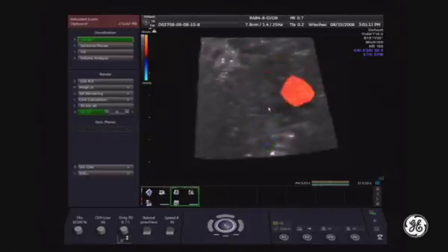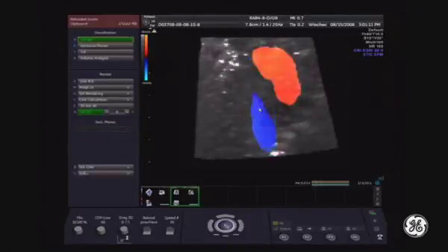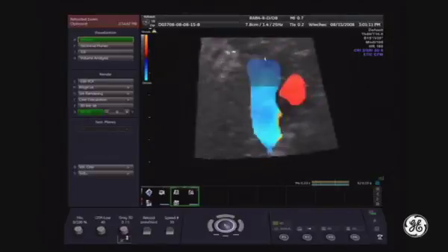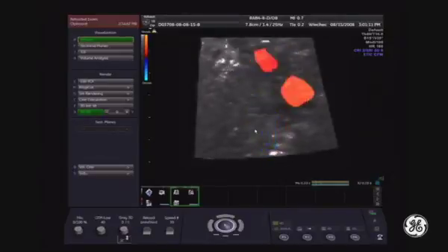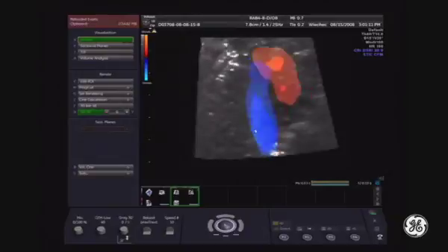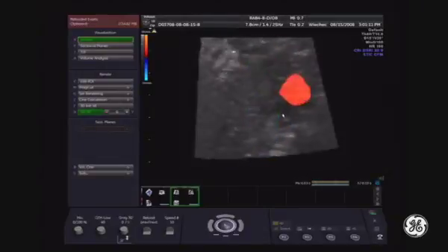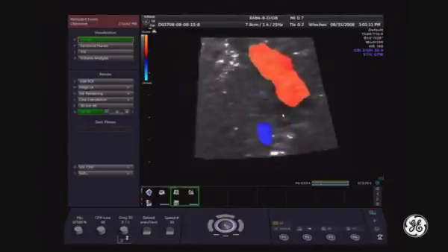Normally we should expect another red inflow here. This is the outflow from the anterior ventricle, which is straight, which is very typical course for the pulmonary artery. And here you can see the retrograde filling of the aortic arch. So one screen, and all the features for hypoplastic left heart are very, very clear.